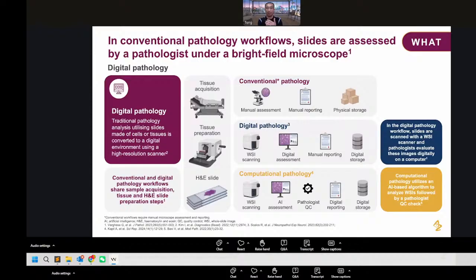Since probably half of us in the audience are from academia and research, you may not know exactly how this tissue handling works in the clinical lab, the anatomical pathology lab. Basically, the surgeon or the tissue takers, when patients are suspected to have cancer, you have to get the cancer tissue and identify whether these are real malignant cancer cells.